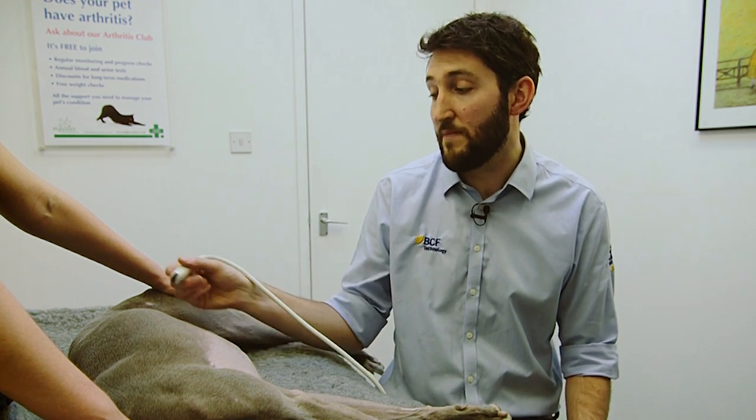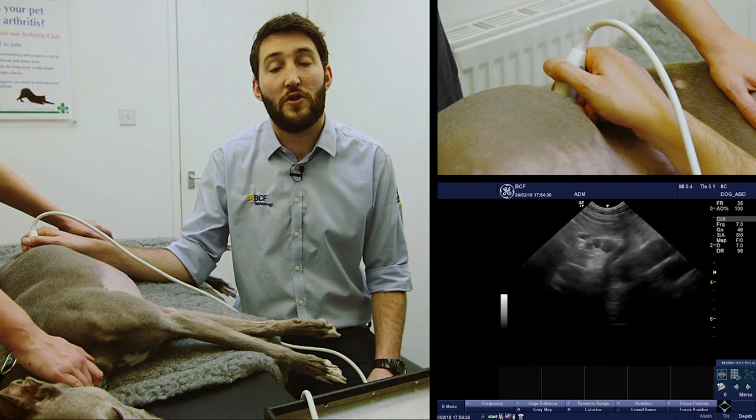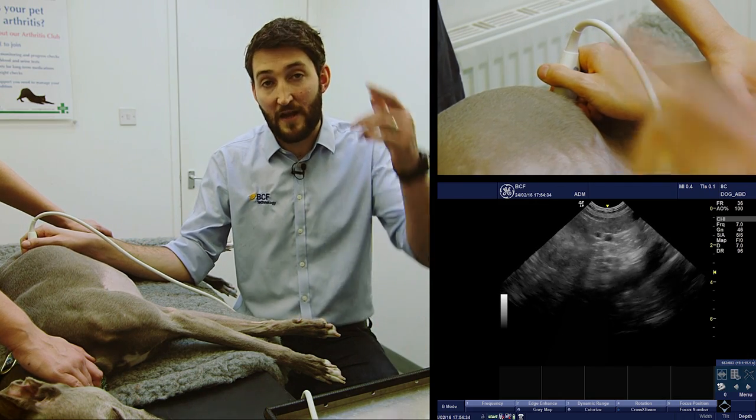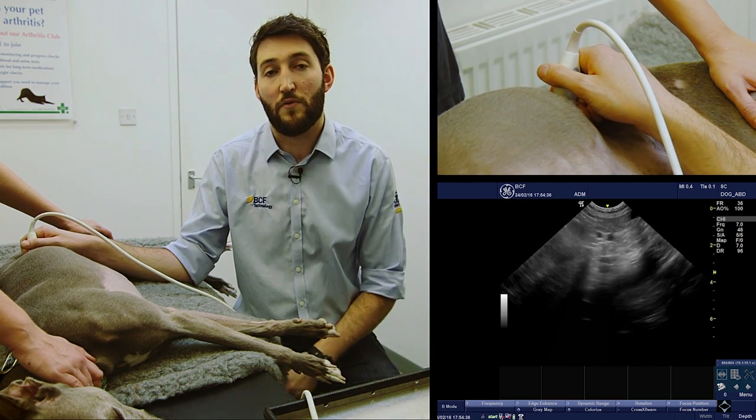They also serve as superb landmarks for some of the other organs that we'll look at a little bit later on. To start scanning these, we're going to begin by placing our probe just caudal to the costal arch in a longitudinal plane, and we're going to stand the probe as nearly upright as we can so that we're scanning from above directly down towards the tabletop.